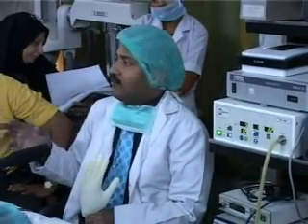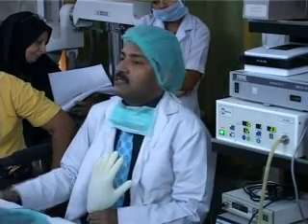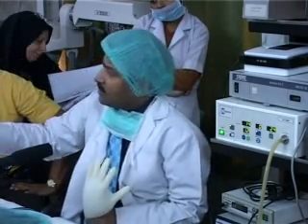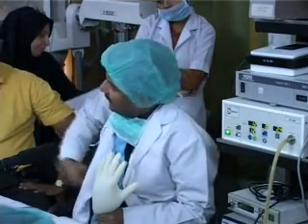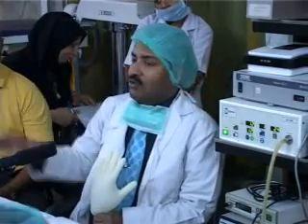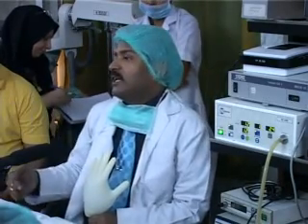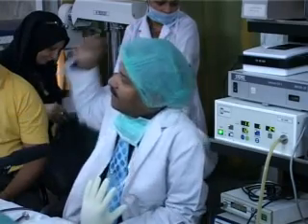It is giving the alarm purposefully: if you are doing something, then finish your task. What happens? Suppose you have put your primary trocar and then you are putting your secondary trocar. There is some pressure there because of the pressure which you are exerting, and at that time actual pressure will rise. So the insufflator will wait for 5 seconds and give you an alarm. But within 5 seconds, if you could not introduce your trocar and cannula, then it will take the gas back.